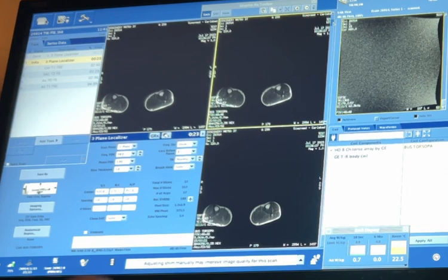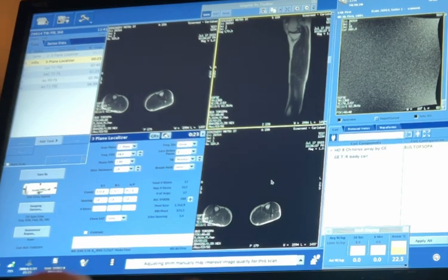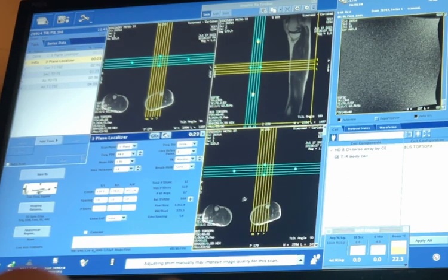There you go. So we don't have any coronals. Okay. So go back. That's the best one we have. Right? Okay. So let's drop it on our axial. Left click. It's not doing anything. There you go. Okay. So let's move those horizontal slices right over the bone.